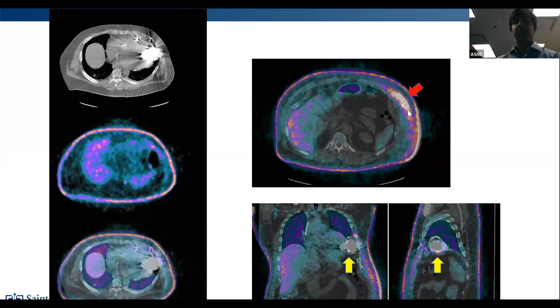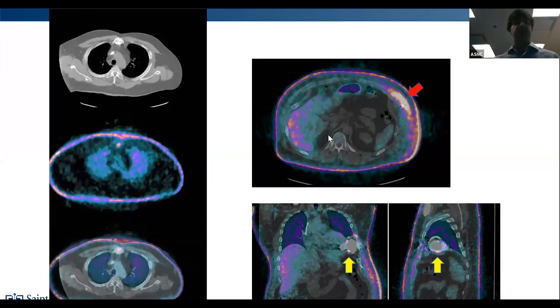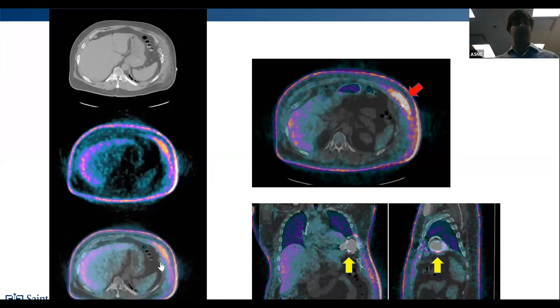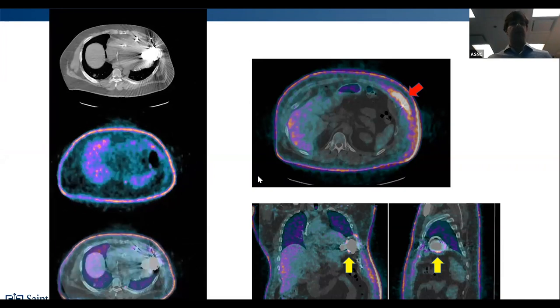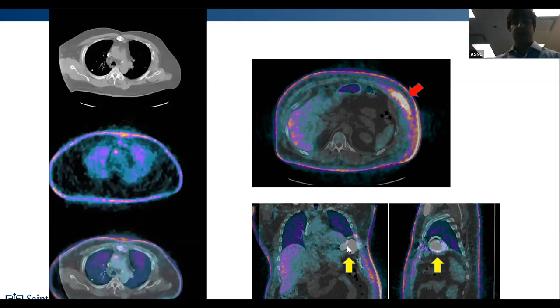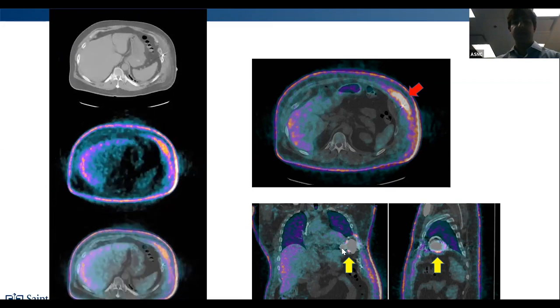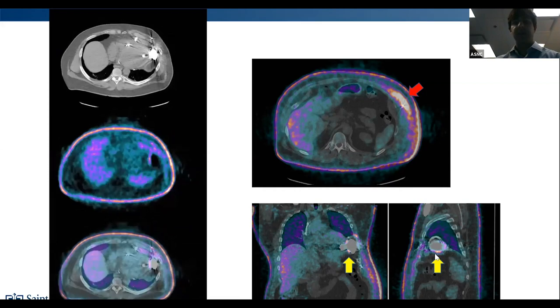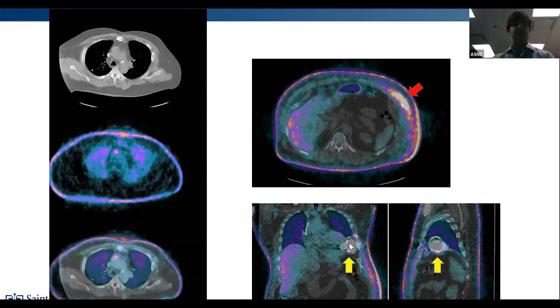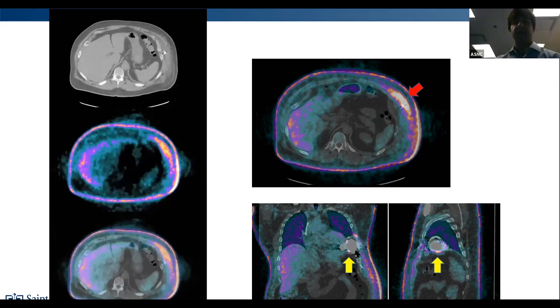There's a lot of uptake here in the subcutaneous tissue along the drive line, but this doesn't really make it into the chest cavity, or into the actual pump body, and you can see down there. One thing that you will notice on some of these is, if you remember what this HeartMate 3 pump looks like, it gets sewn into the LV apex. And around the sewing ring, you can see some mild amounts of FDG uptake that are around the suture pledgets. These are usually not concerning, and not consistent with infection. So you do see that on a lot of these studies.